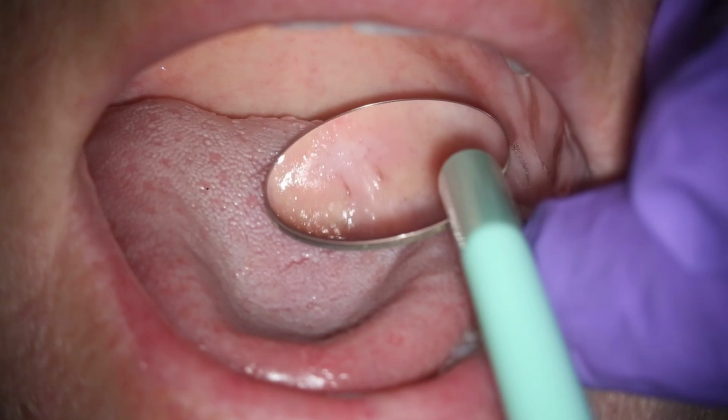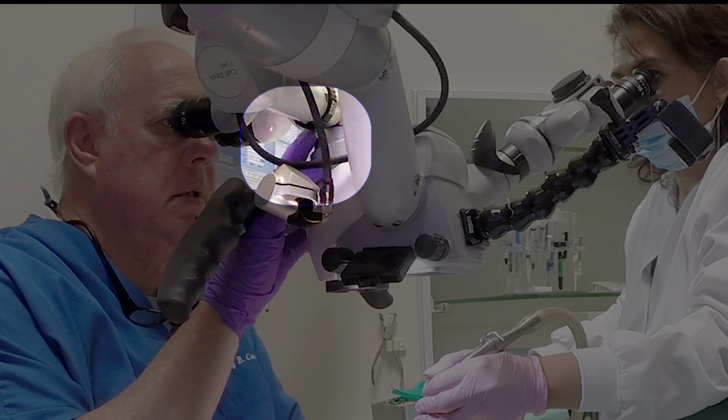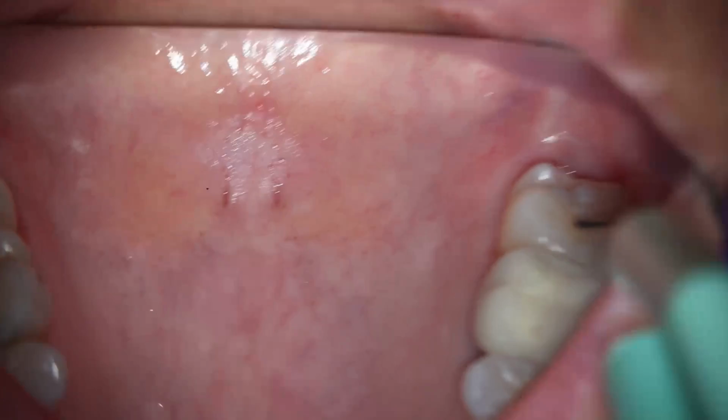So back to our case with the larger mirror, you can see that Joy has the suction off to the right side of the mirror. I am holding the mirror and adjusting the light levels, and we want to get a picture of this at various magnifications. Here you can see she's controlling the fogging, and because she can see through the assistant scope, she knows the precise place to place the suction tip to minimize the fogging. And here I'm able to zoom in, focus with my knees, and Joy can get a great picture for me.